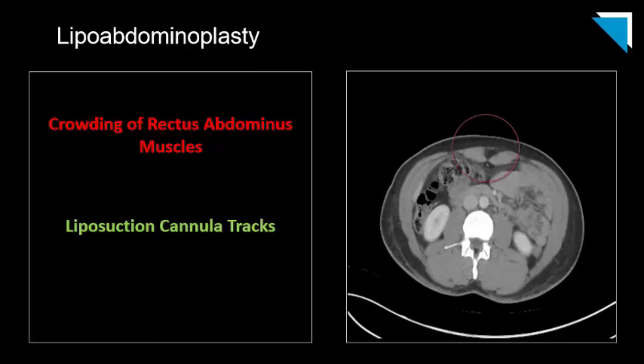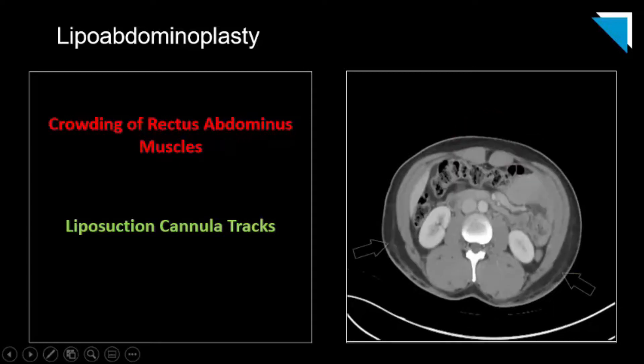The midline crowding of the rectus abdominis muscles is the imaging giveaway that the patient has undergone the procedure. The red circle shows the typical midline crowding of the rectus abdominis muscles, and the green arrows demonstrate the liposuction cannula tracts.